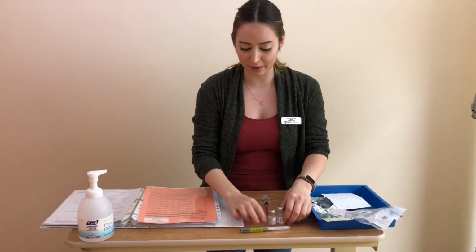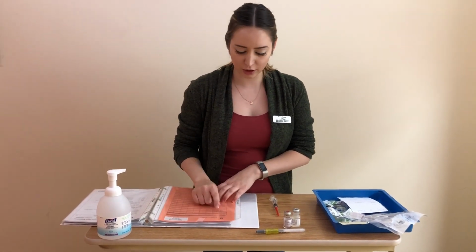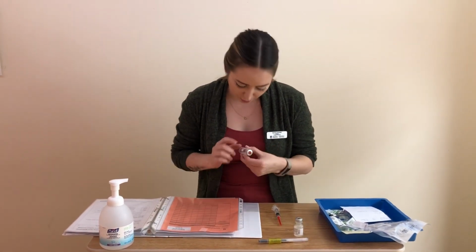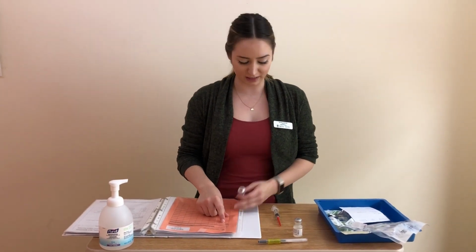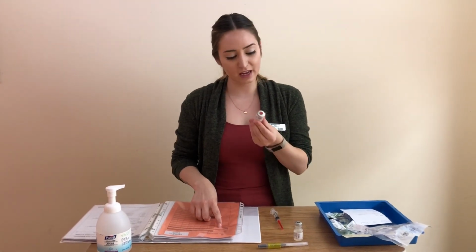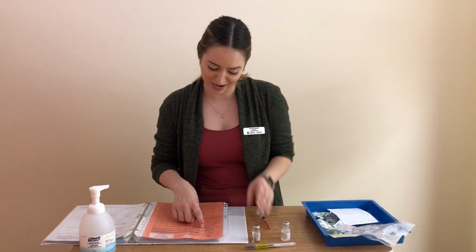So before I go any further, I'm going to do my second med check here. Right patient is Emma. Right drug is methylprednisolone. Right dose is 75 milligrams, which is 1.2 milliliters, which is what I have in my syringe. Right route is IV, and this can be given IV, and right time is now.